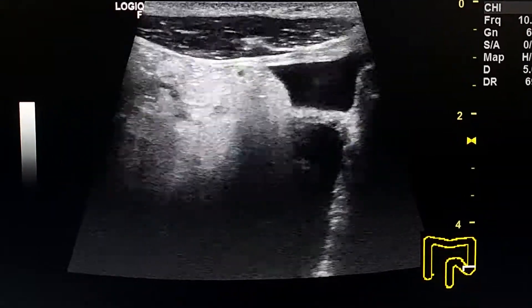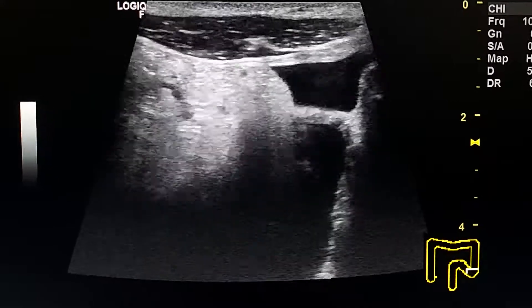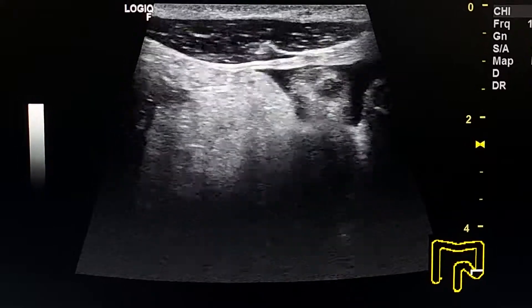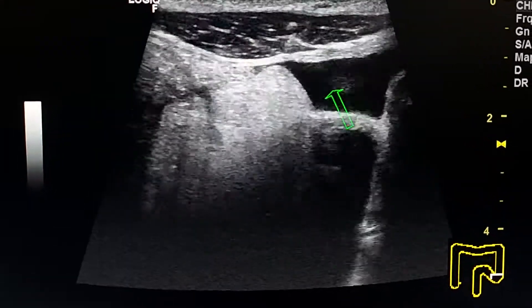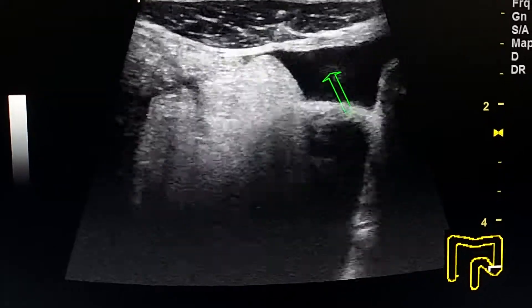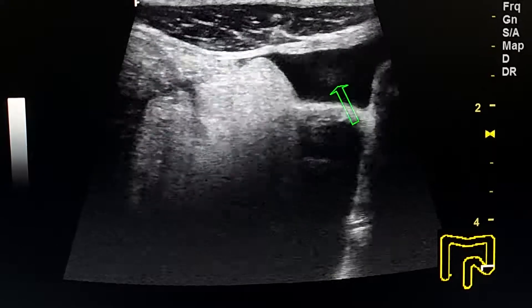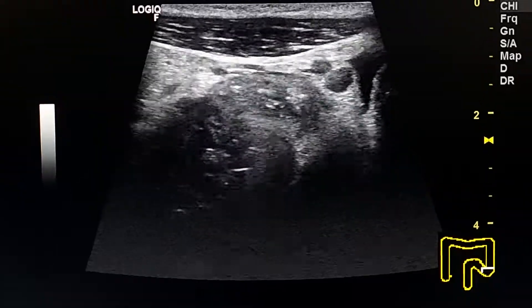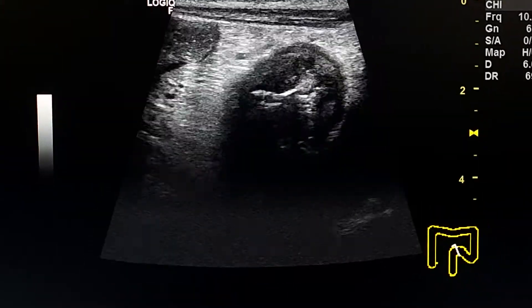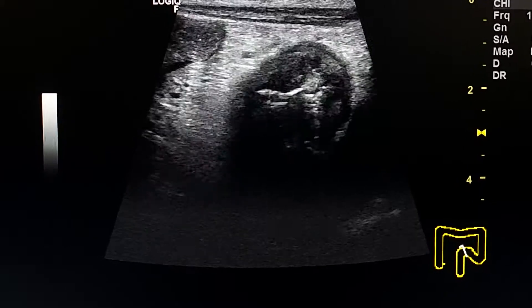Here we see a small amount of ascites in the left iliac fossa. And here we see two enlarged reactive lymph nodes. This is the sigmoid colon.